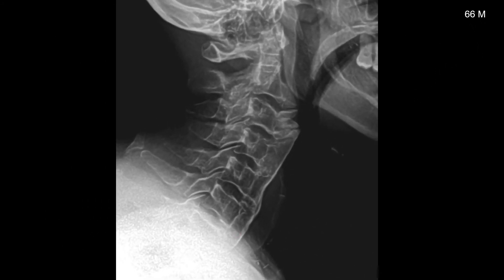This is a 66-year-old male with a history of diabetes. You'll notice flowing hyperostosis of the anterior longitudinal ligament, no evidence of ossification of the posterior longitudinal ligament, relative preservation of intervertebral disc height, and lack of posterior element involvement.